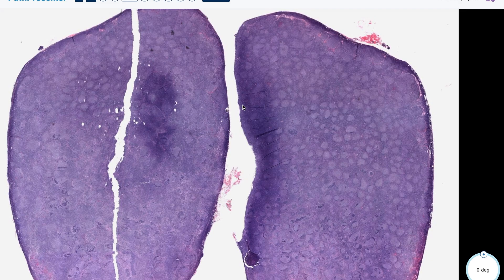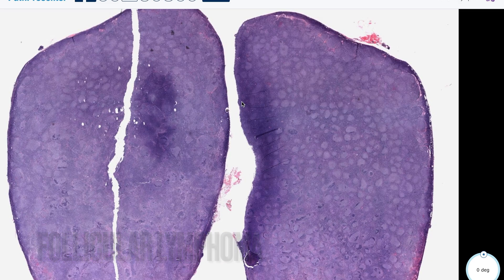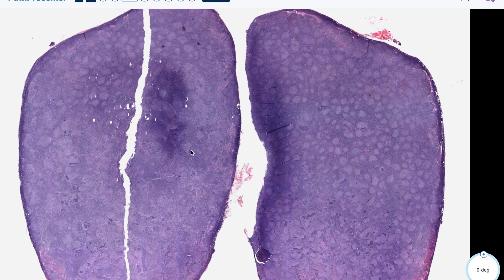Follicular lymphoma is a neoplasm of germinal center B cells with varying proportions of centrocytes and centroblasts, or large transformed cells, and at least a partially follicular growth pattern — which is what we're seeing here at low power. All of these follicles can really be appreciated and kind of stand out, not something that you see in every lymph node that you look at.